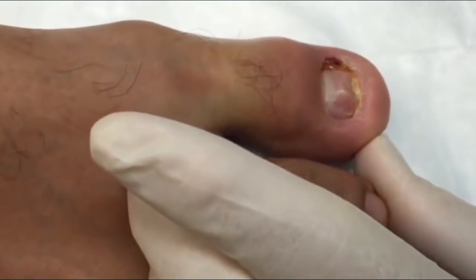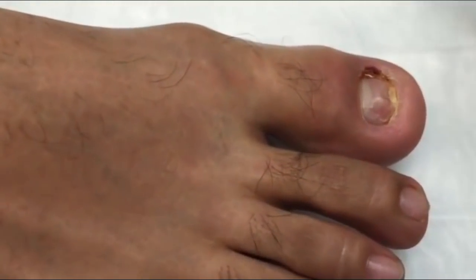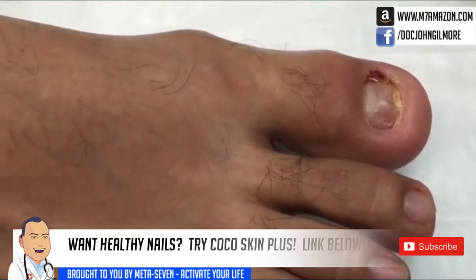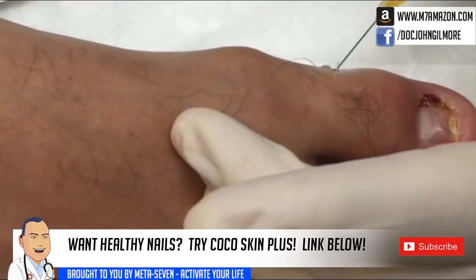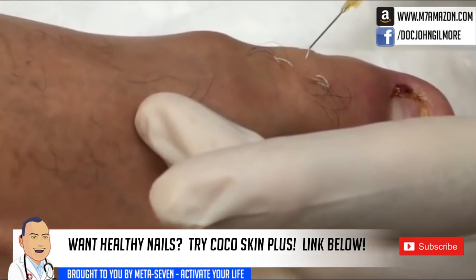All right, so let's get the cold spray. We'll start off by doing a digital block. You ready? Stick, sting, and burn. Stick, sting, and a burn. That's right.